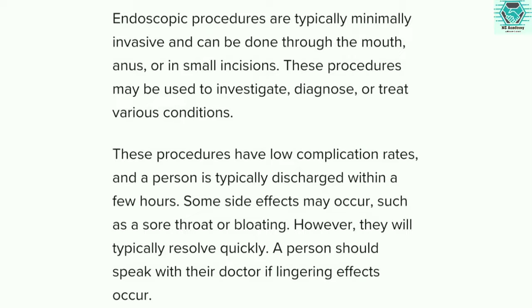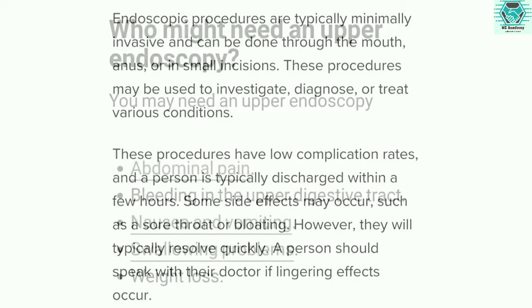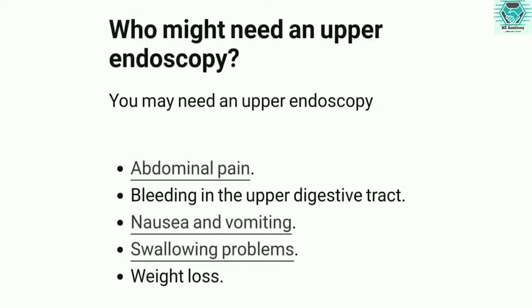So these are typically used to help the doctor determine the cause of any abnormal symptoms you have, remove a small sample of tissue which can then be sent to a lab for further testing like a biopsy, and help the doctor to see inside the body during a surgical procedure such as repairing a stomach ulcer or removing gallstones, tumors, etc. So there are a lot of advantages of endoscopy.